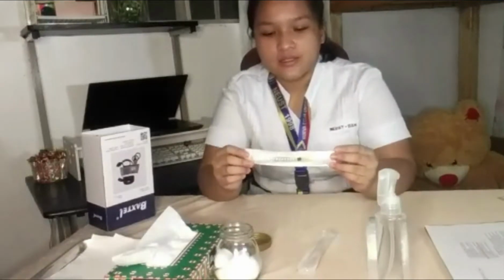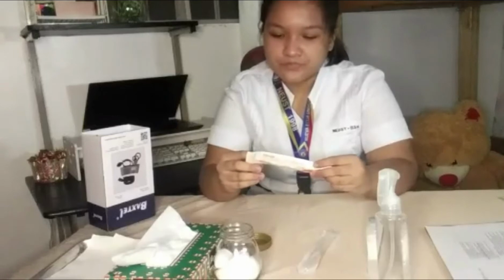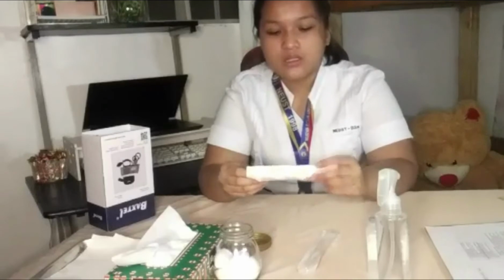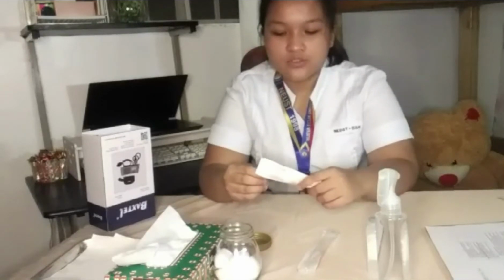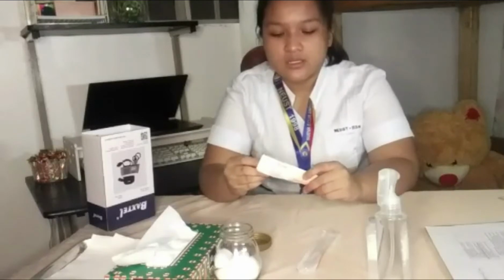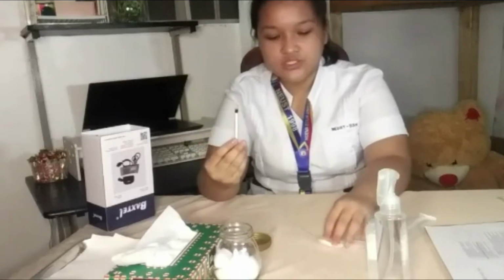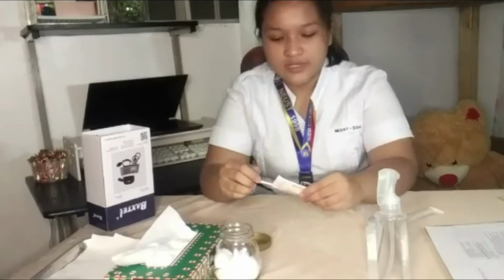Okay, now let's start on preparing our medication. Again, we are going to use a tuberculin syringe. I am not going to touch the barrel since this is a sterile packet. Before I remove the whole syringe out of the packet, I am going to leave and remove the needle that I'm going to use for my patient on injecting the medicine. I'm going to replace the syringe needle with an aspirating needle.